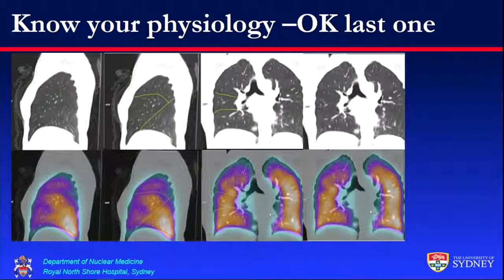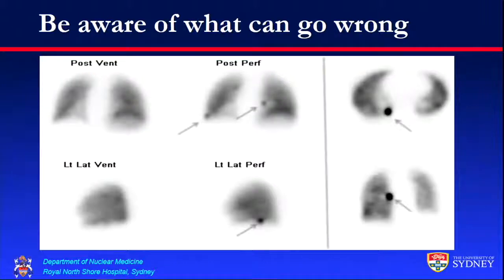So the fissure sign we feel is due to lack of penetration of the MAA all the way to the pleural surface. If you look at the pleural surface of the lung, the alveoli extend beyond the terminal capillaries. So your MAA is going to impact short of the surface, but the technegas will get all the way out. And of course, at these pleural reflections, you've got a double thickness of that effect. And so you'll get areas here where perfusion doesn't make it all the way on both sides, but the ventilation does. And so you'll see linear areas of reduced uptake. And the trick again, as Marika keeps pointing out, these are not segmental, these are straight lines. If you do a SPECT CT, you can align them again.